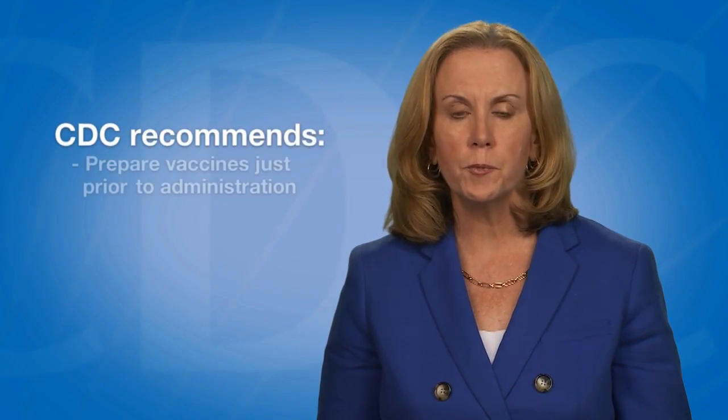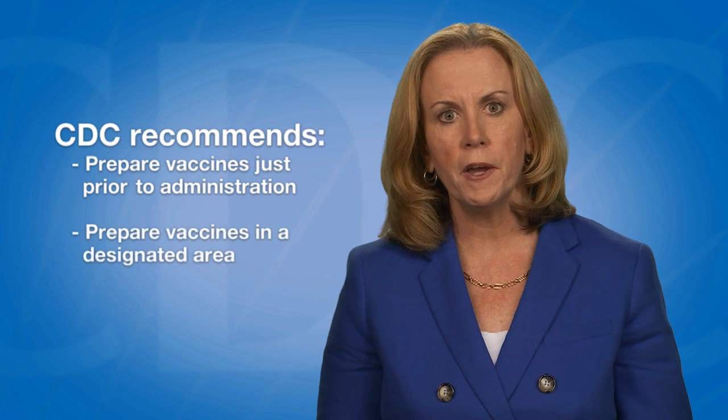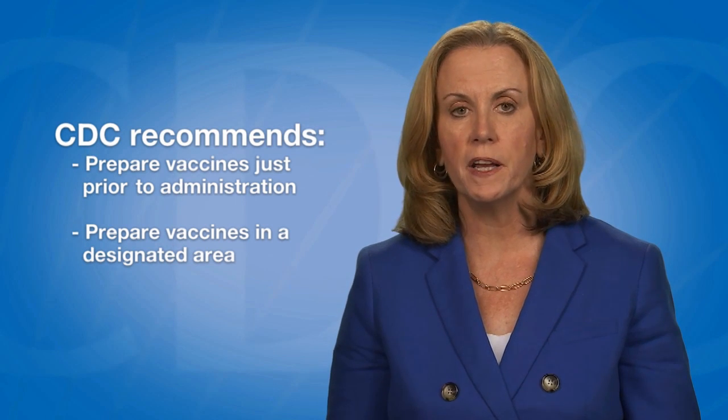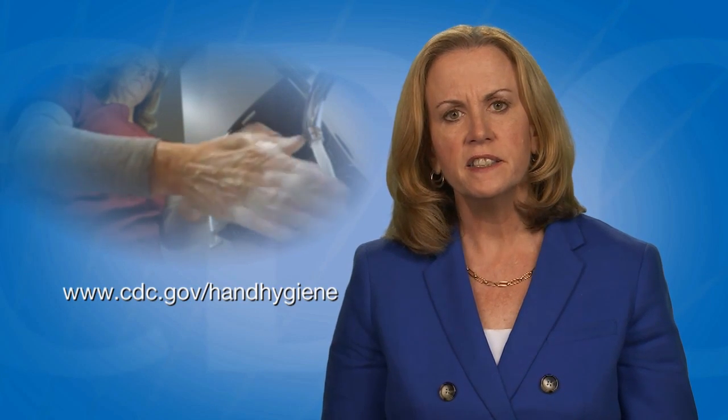CDC recommends that providers prepare and draw up vaccines just prior to administration. Vaccines should be prepared in a designated area that is not adjacent to any area where potentially contaminated items are placed. Before preparing or administering any vaccine, always start with proper hand hygiene. CDC has hand hygiene guidelines and resources for healthcare personnel available online.